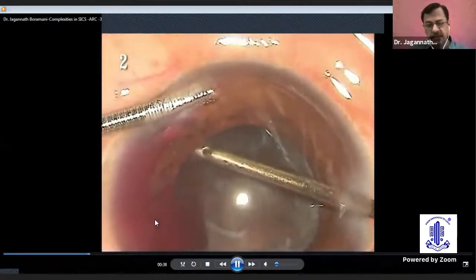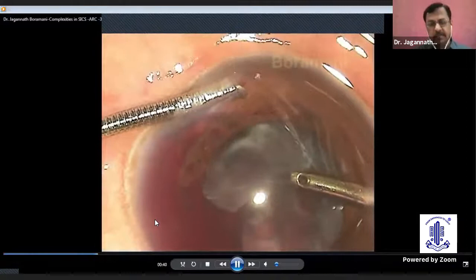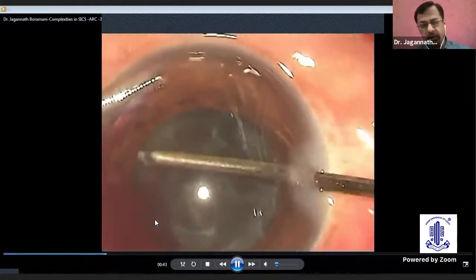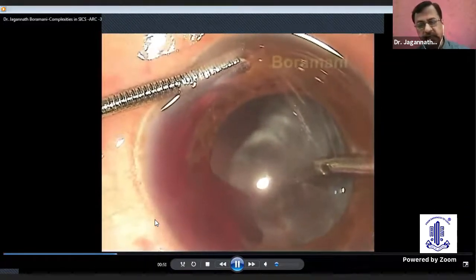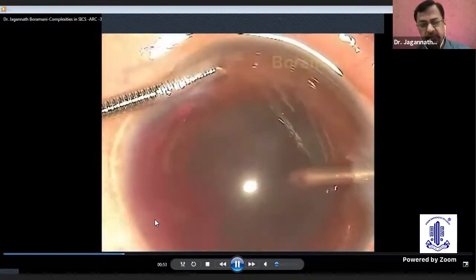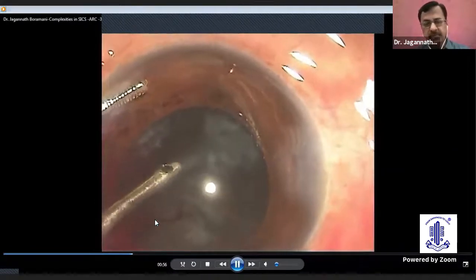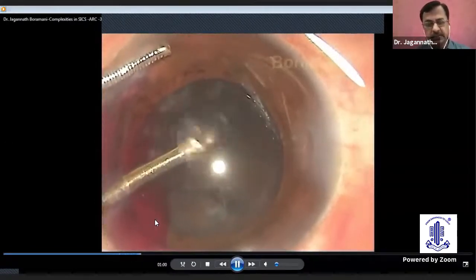In this case, I used the AC maintainer. Somehow there was an intraocular hemorrhage. The visibility was not very good, and I was trying very hard to pull the cortex from the region below the AC maintainer. Somehow it was not coming, and then suddenly I realized that I am pulling the capsule. Because of that, there is capsular dialysis, zonular disinsertion almost in one third quarter. So I took a left-sided side port again and started doing the remaining part of the surgery.